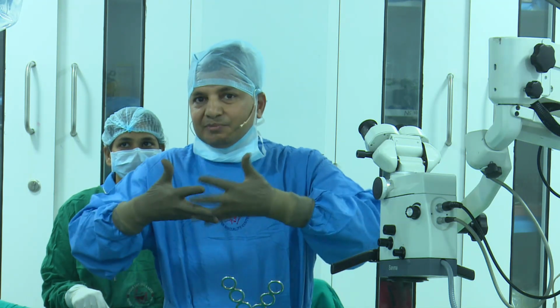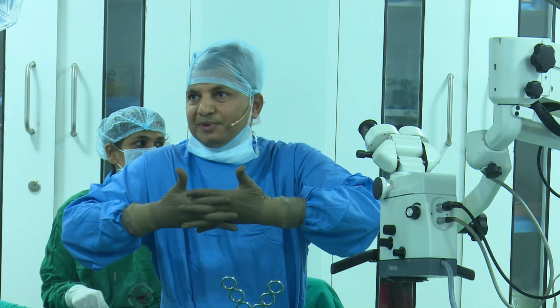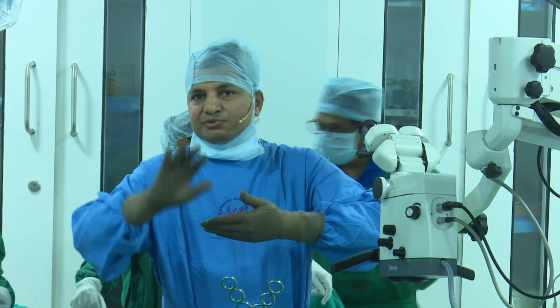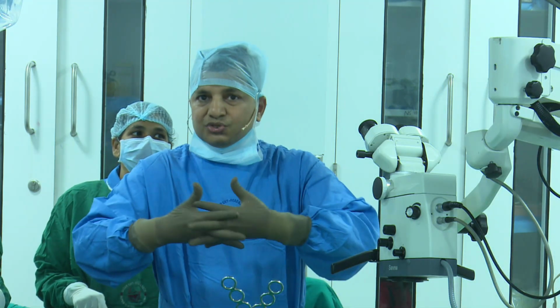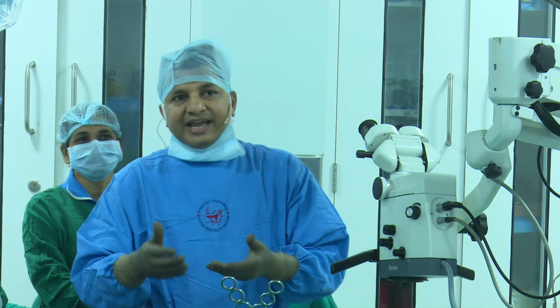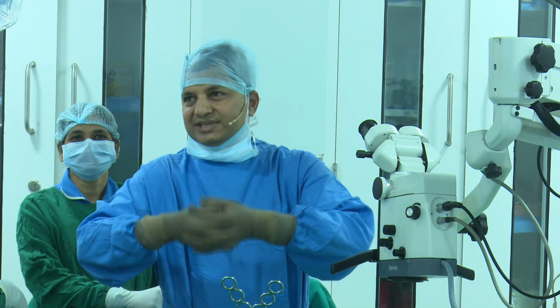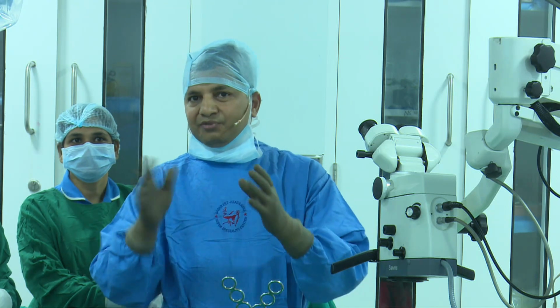High base tongue will be supported by my non-absorbable suture. It will sit right on the soft palate, right? So I am not bothered about high base tongue collapse. Anyway, there is no surgery for high tongue base collapse. The lower tongue base collapse was not a problem. High tongue base collapse was not happening in this case. But if at all it happens, my suture, the suspension bridge, has two functions. One is to not let the soft palate collapse, and one is to not let the high base tongue collapse. It will suspend both. And therefore, you saw how much time I took to put those sutures correctly in position and very deep into the soft palate. So this non-absorbable will remain for life.